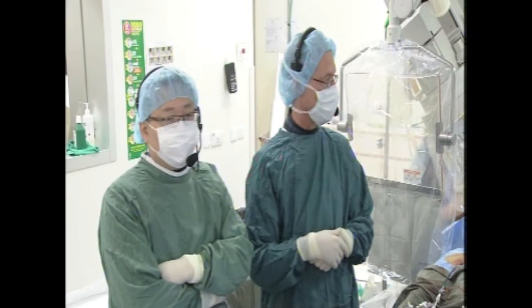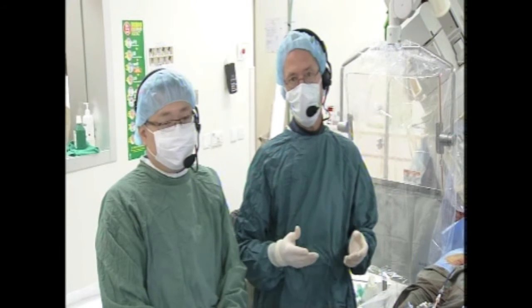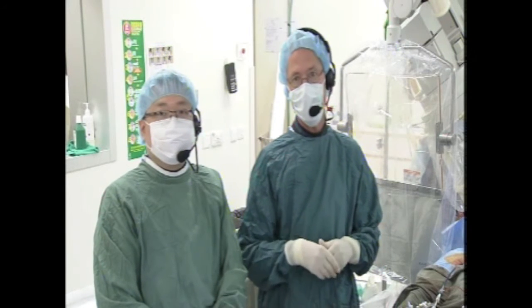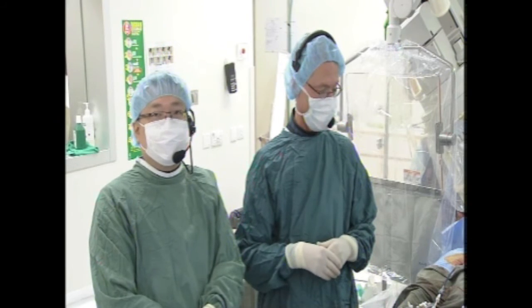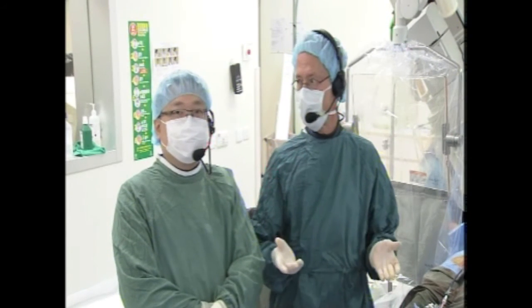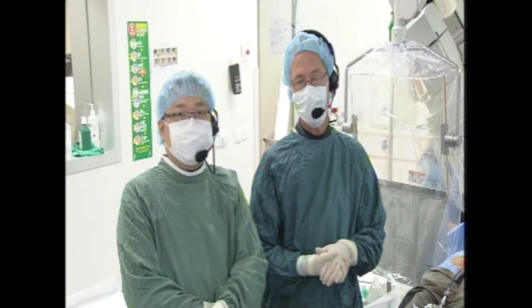And if there is a residual leak, this combination is not very frequent, but if it happens, then I would not do any more during the same procedure. I would wait some months and then close the residual leak with another device or an additional device. Okay, and how long are you going to wait? We usually wait 4 to 6 months, but it's probably also possible to do it earlier, but I think there's no harm to wait such a time.